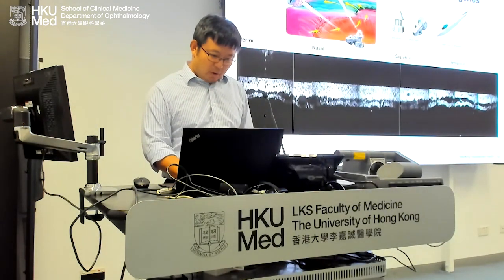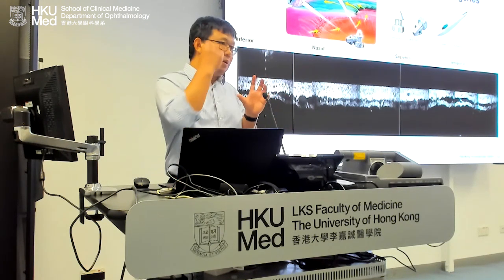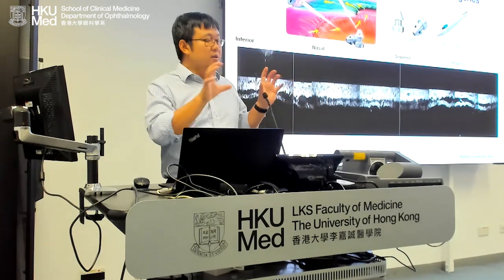Eventually, we want to map the whole Schlemm's canal. And once we map Schlemm's canal, we want to visualize the collector channels 1, 2, 3. We want to map the collector channels around the whole 360 so that we know where the concentrations are. Each patient will be different, and this will provide guidance for the stent surgery.